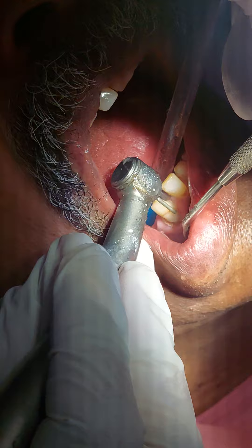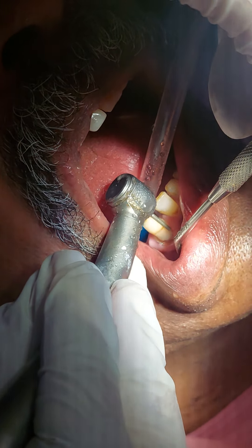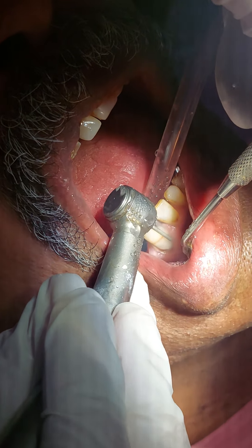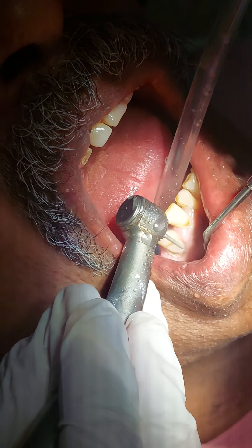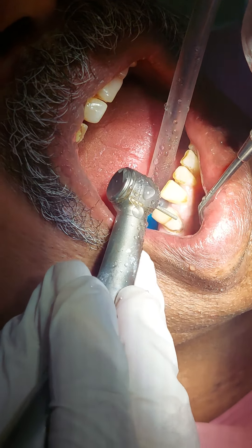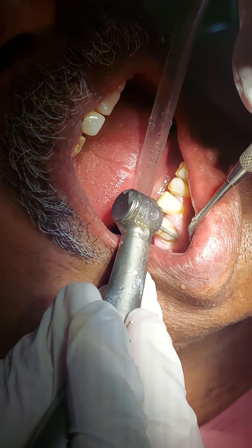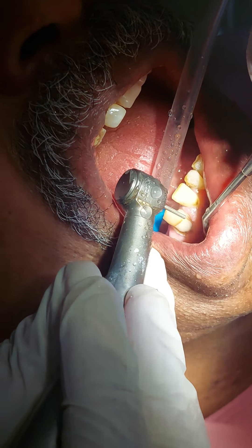Going down, going closer to lingual — see there's a small undercut on this angle. Do you see it? Beneath the bur, look closer — there's a small empty triangle beneath the tip of the bur. So where am I preparing? I'm actually preparing with the body of the bur in this area. I'm removing the undercut by preparing the bulge over it.